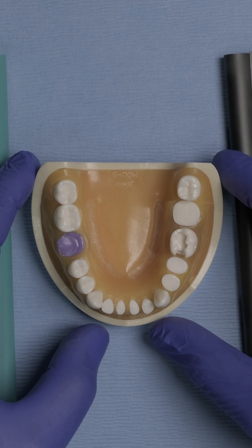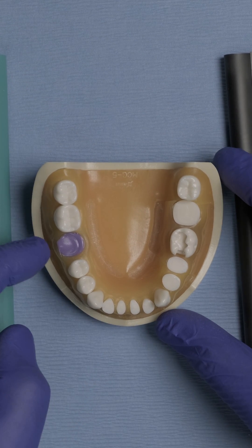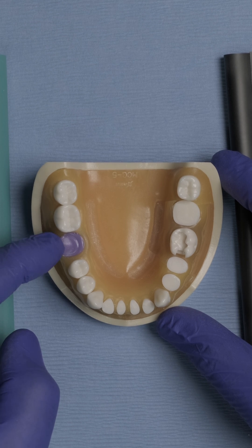Now in this example, we're going to use this denteform. As you can see, we have extracted tooth number 30.